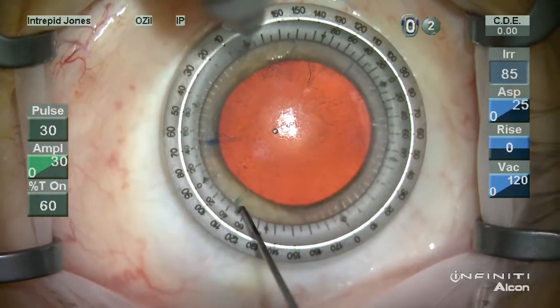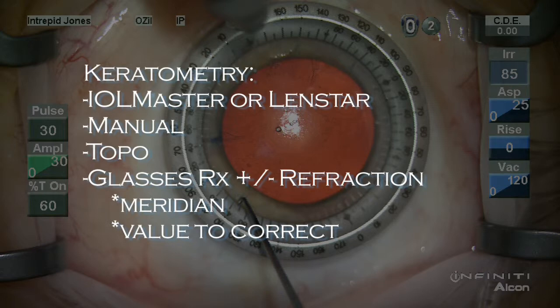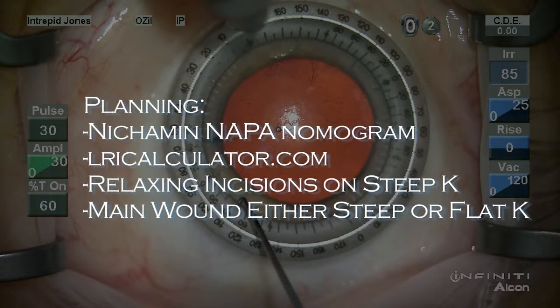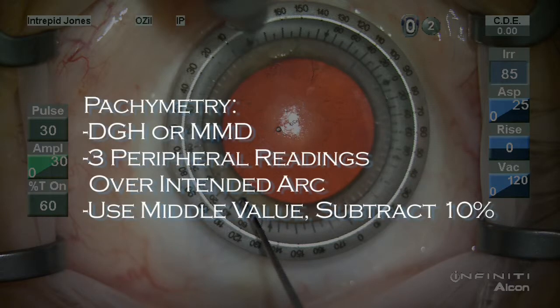Now I use several elements to ensure that I have good keratometry, in particular automated IOL master or Lenstar Ks, manual Ks, and topography Ks, and I will look at glasses RX or refraction for both astigmatism value and meridian. You want to use topography to ensure that you're working on regular astigmatism and avoid non-orthogonal or irregular patterns. In the planning phase, I use the Nichamin NAPA nomogram, which can be found at lricalculator.com. My incision for relaxation is placed on the steep K, and the main wound on the flat or steep.